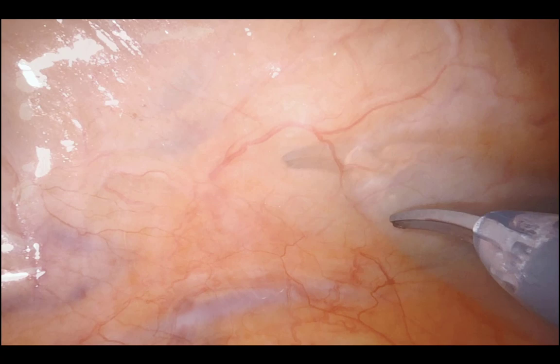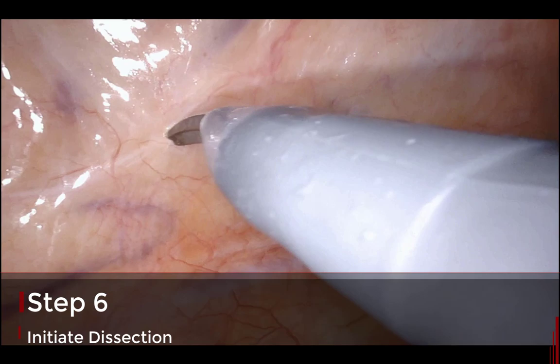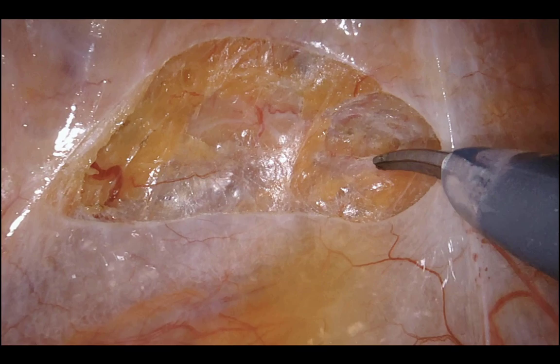Jiggling the peritoneum, making an incision — pneumo-dissection starts kicking in right there into the presacral space.